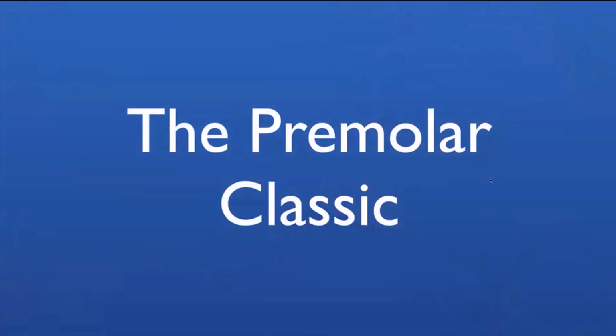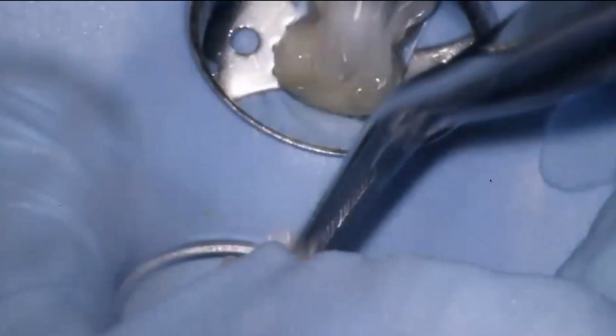The premolar classic is a little bit different because the struggle with a premolar is the access cavity is smaller. There have been many things and techniques that I've been exposed to over the years. But what I've learned on my own, with trial and error, is that for a premolar, with a smaller access, you just have to extend the channel of the platform build coronally so that you can fit your matrix in appropriately. So I'm going to show you an example of a premolar.